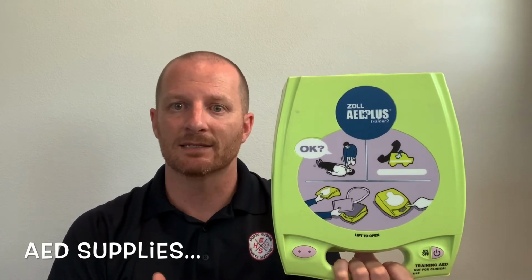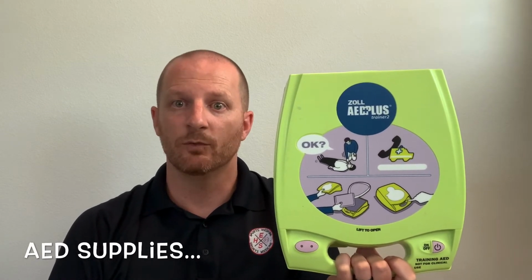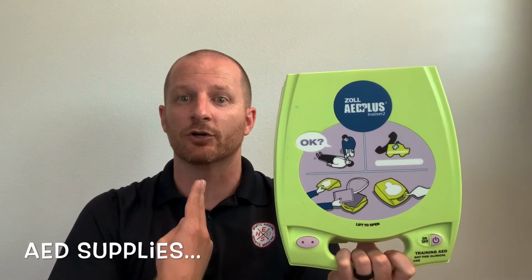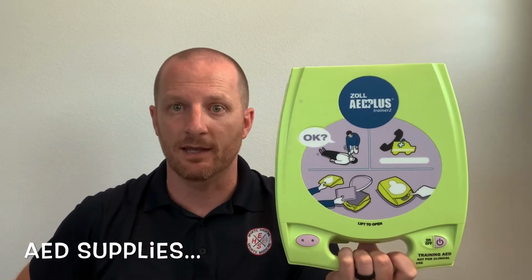Inside of the AED has a bag with some supplies that I want to discuss. First supply is a pair of scissors. We can use these scissors to cut the person's shirt or jersey off because we want the pads of the AED to be directly on the person's skin.